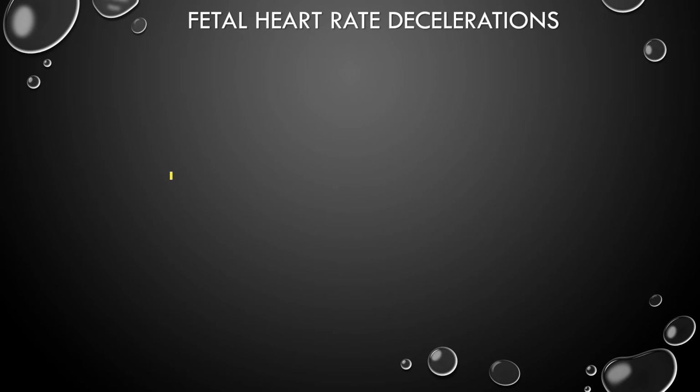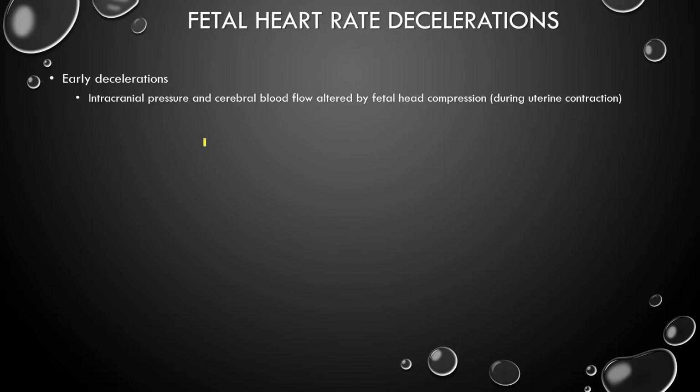Now let's talk about fetal heart rate decelerations and the different types that we have here. So the first type is early decelerations. We'll talk about what this means shortly. An early deceleration is caused by fetal head compression.